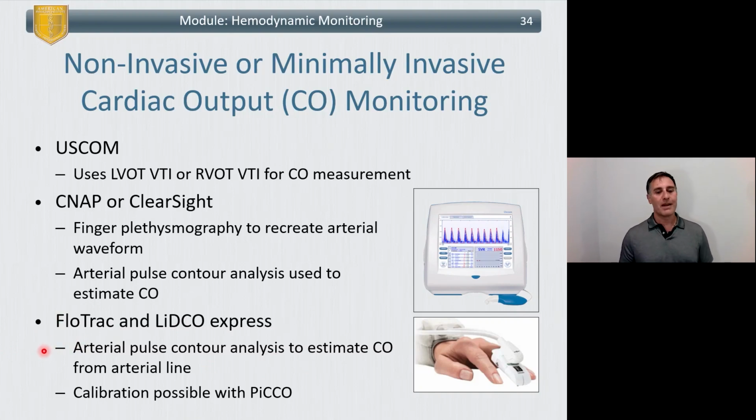So for these, you need an art line. For these, you don't need anything. So this is truly non-invasive, and this is what I would call minimally invasive, with full invasive being something like a PA catheter. So a few options to measure cardiac output, and depending on what your patient has, that may be important for management.